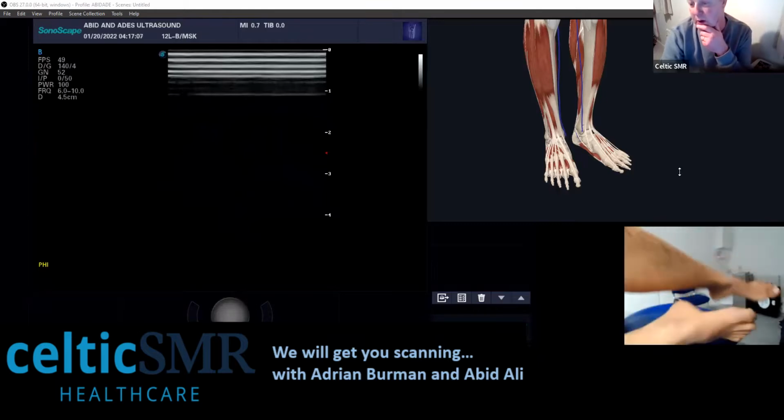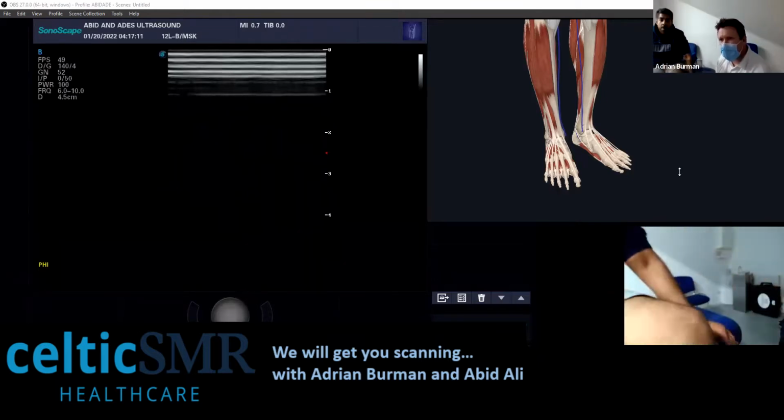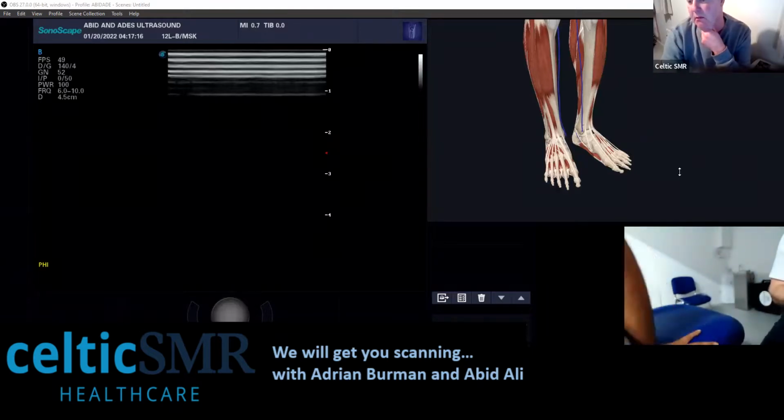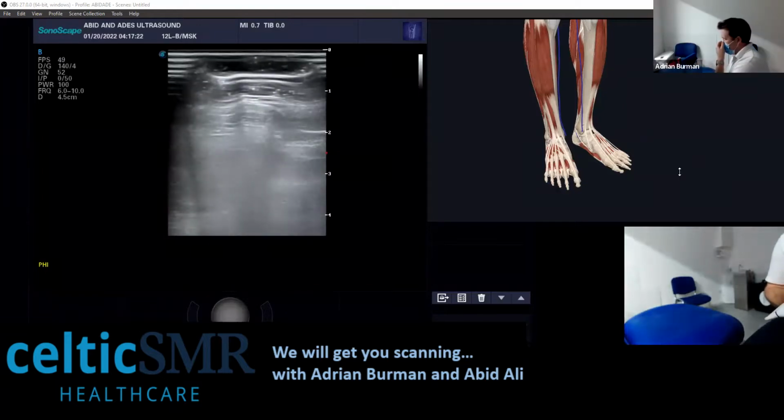All right, what else have we got? Lateral ankle. Yeah, here we go. A lateral ankle, please, inclusive of ligament complexes: AITFL, ATFL, CFL.